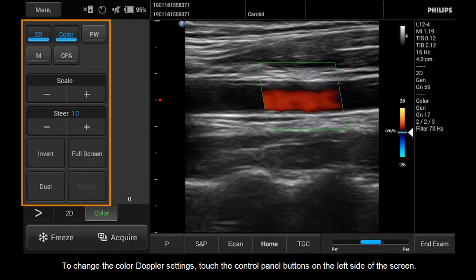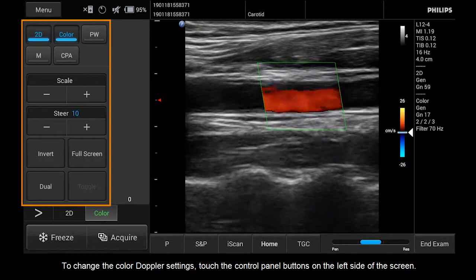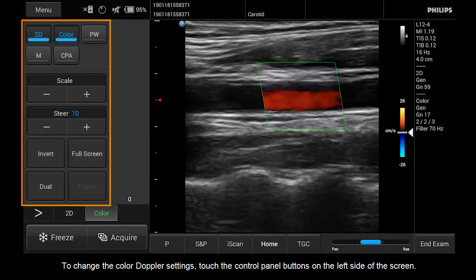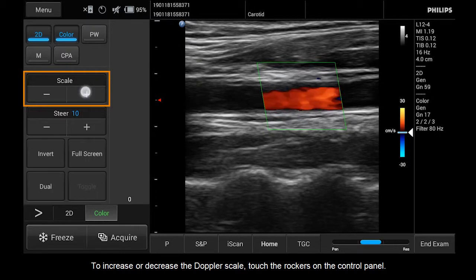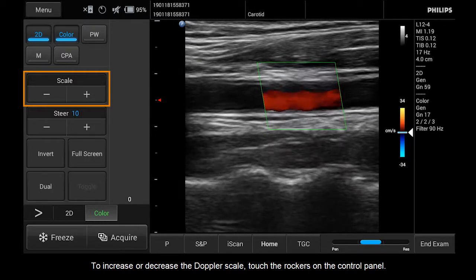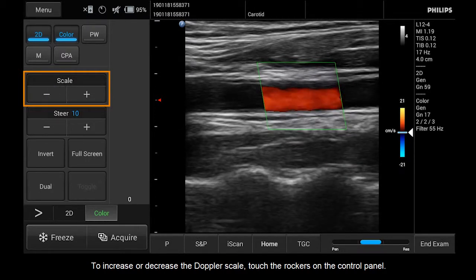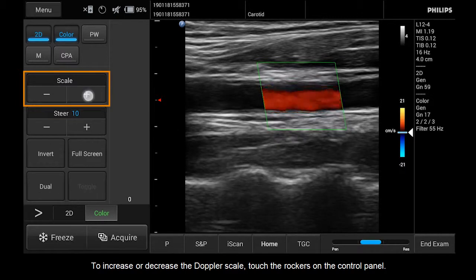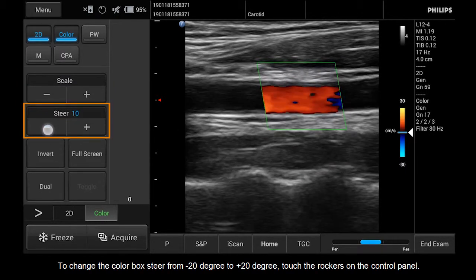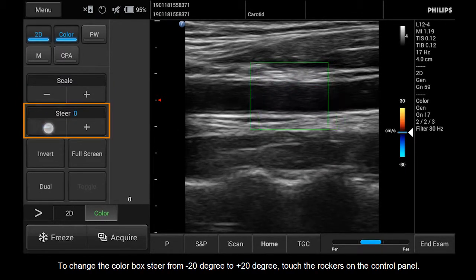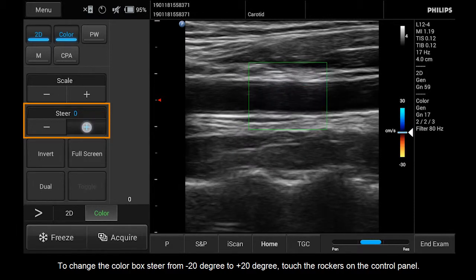To change the Color Doppler settings, touch the Control Panel buttons on the left side of the screen. To increase or decrease the Doppler scale, touch the rockers on the Control Panel. To change the color box steer from negative 20 degrees to plus 20 degrees, touch the rockers on the Control Panel.